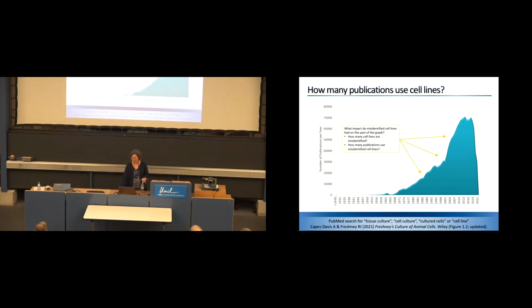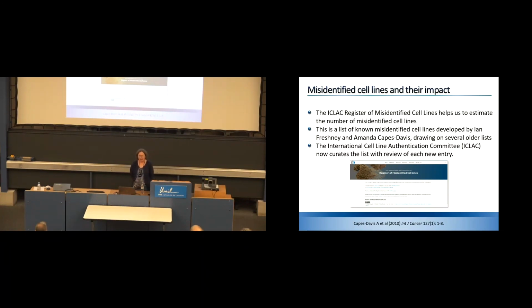Stan Gartler found 20 cell lines, but how many are there these days that are affected by that? And how many publications use them? So we can get a partial answer from the ICLAC Register of Misidentified Cell Lines. So it's essentially a very simple list, with apologies to bioinformaticians everywhere. It was developed by Ian Freshney and myself, drawing on several older lists, and is now curated by the International Cell Line Authentication Committee. So the group is basically a voluntary group of experts in this area that review reports that come out of problematic cell lines and try and decide, should they be registered as having this specific problem?